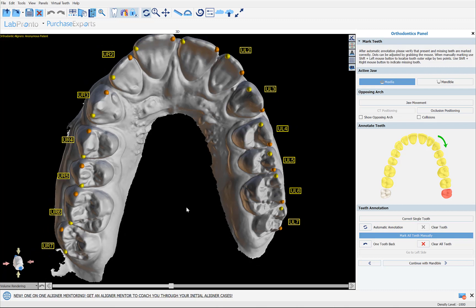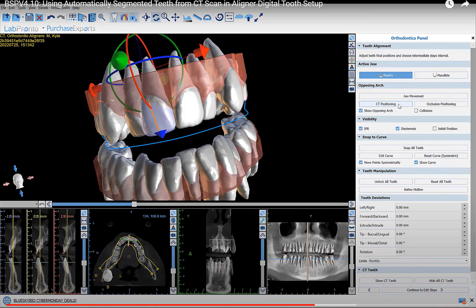Later in this tutorial we're going to discuss some new tooth control functionality, including the ability to duplicate a particular step in the aligner sequence so you can have complete control over which teeth move next. In addition, in this release we've also added the ability to add a CT scan to your aligner digital treatment plan.